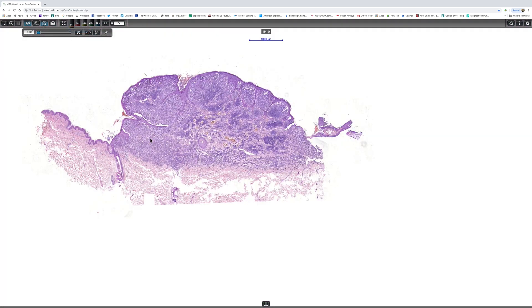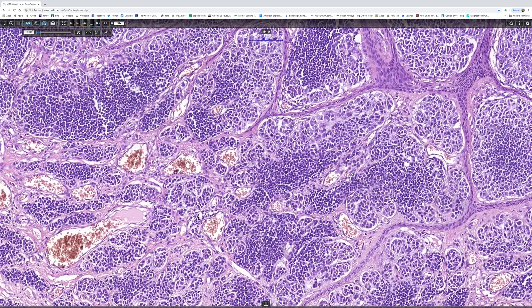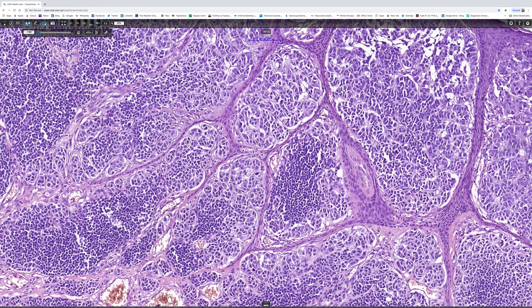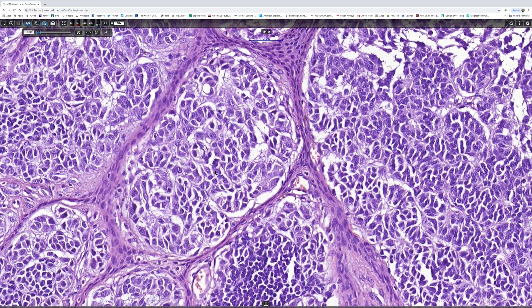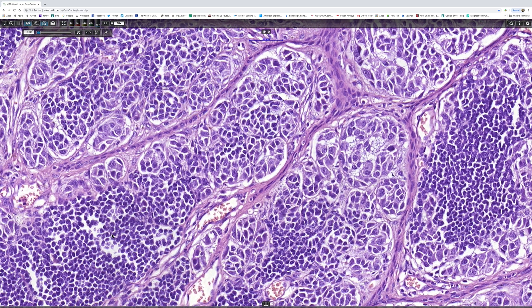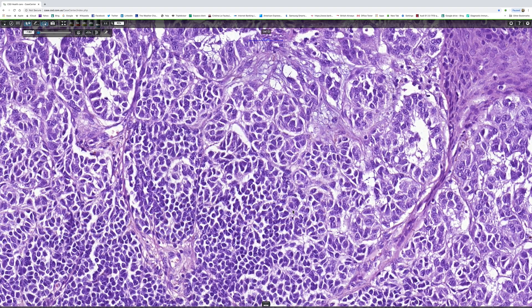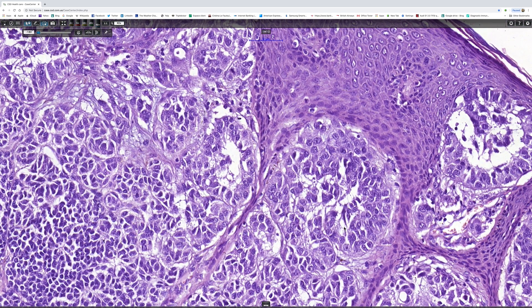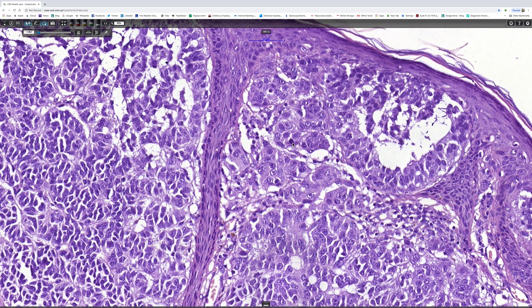Other features to look for in nevoid melanoma include subtle pleomorphism — in this case the nuclei are slightly enlarged and irregular, with rather stippled chromatin. Sometimes in nevoid melanoma you get very prominent nucleoli, but I don't see that as a feature in this case. Lastly, you look for evidence of mitotic activity. After searching, here is one mitosis — and there are actually quite a few, though it's time-consuming to find them.